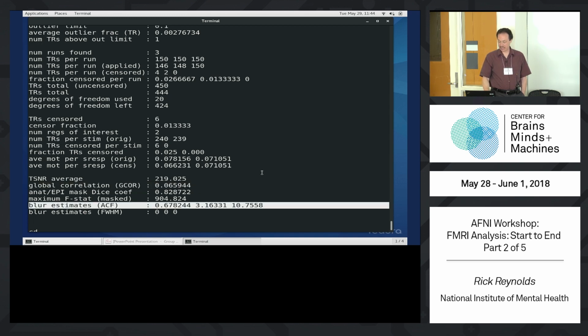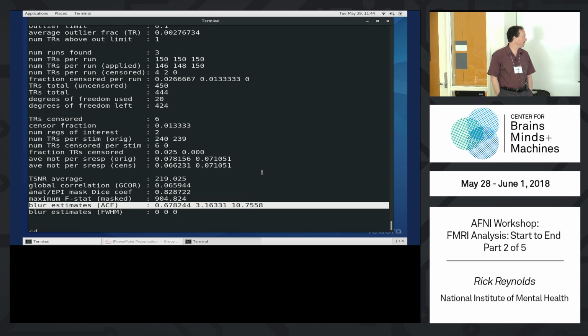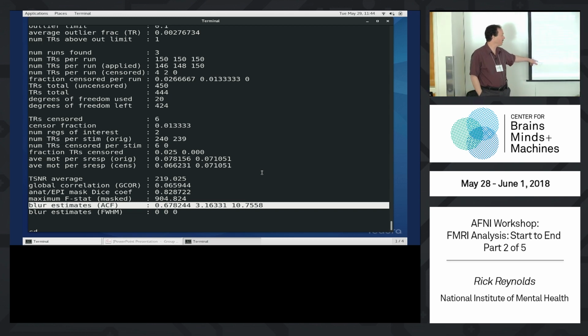These ACF parameters. Did you talk about ACF at all, Daniel? I guess I'll babble about these a little more later.